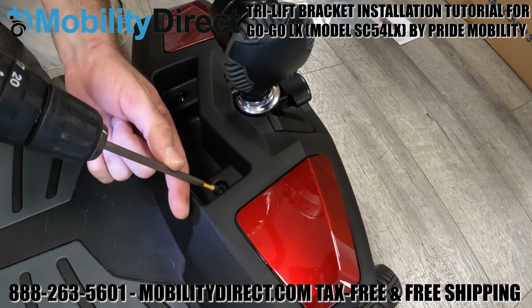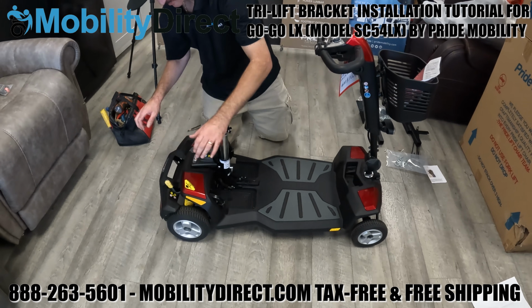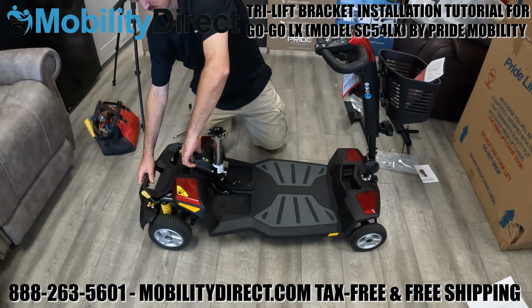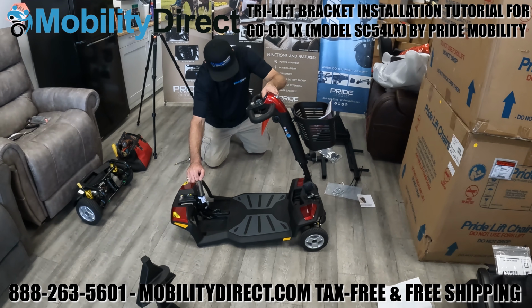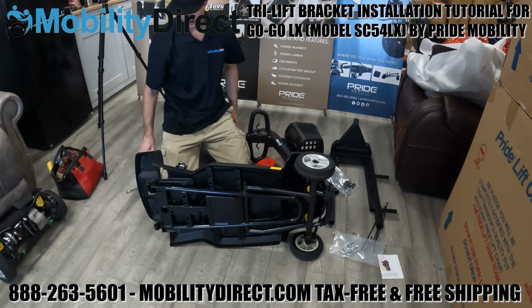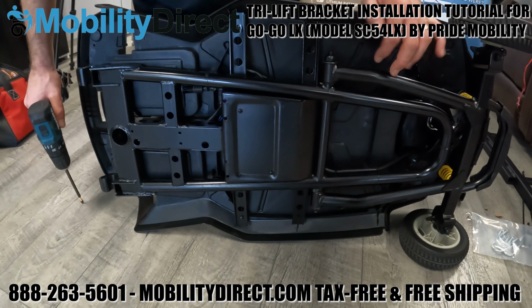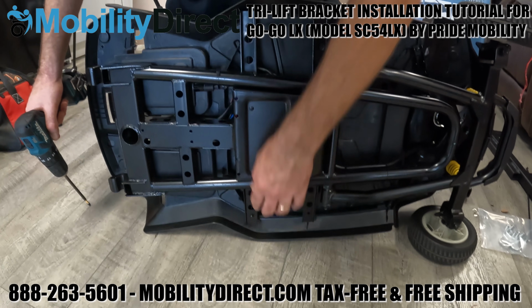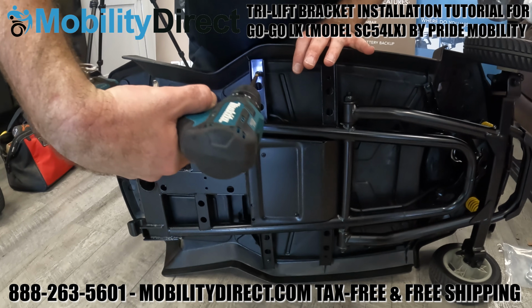Once those four screws are out, you can go ahead and disassemble the front half from the rear half. And essentially, you need to tip the scooter over. We removed the rear half because it makes it easier to work with and it's easier to tip the scooter over. You are going to need to remove four screws from the bottom part of the scooter frame that secure the floorboard to the floorboard from underneath the scooter.